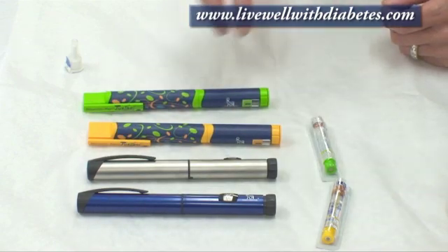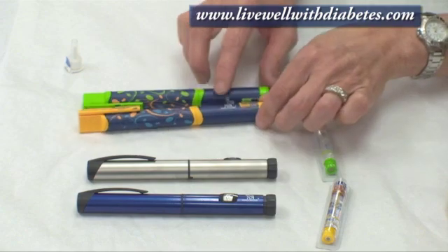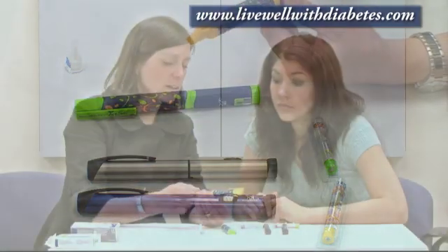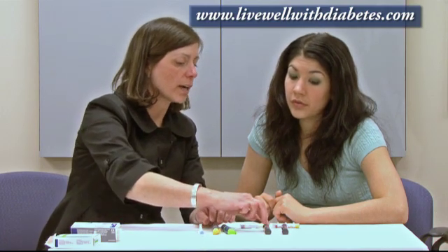These two pens are called Novolin Pen Juniors. They're called junior pens because the dose changes by half-unit increments. Also, the maximum a person can dial on this junior pen is a total of 35 units, as opposed to the regular pen which can dial up to a maximum of 60 units.